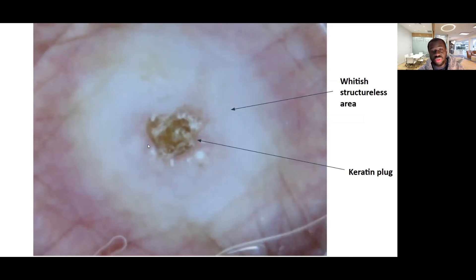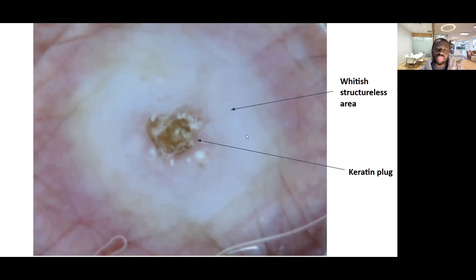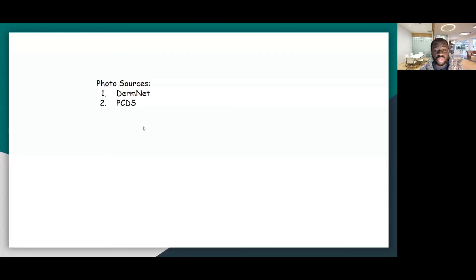This here is a keratin plug — you can see it's a brownish, dark keratin plug. You see the whitish structureless area from destruction of normal skin tissues, replaced with fibrosis, and clearly there is also keratin within there. If you've seen something that looks like this, especially if the lesion is increasing in size, you should be thinking this is likely a squamous cell carcinoma. Sources of this photo: DermNet and Primary Care Dermatology Society.